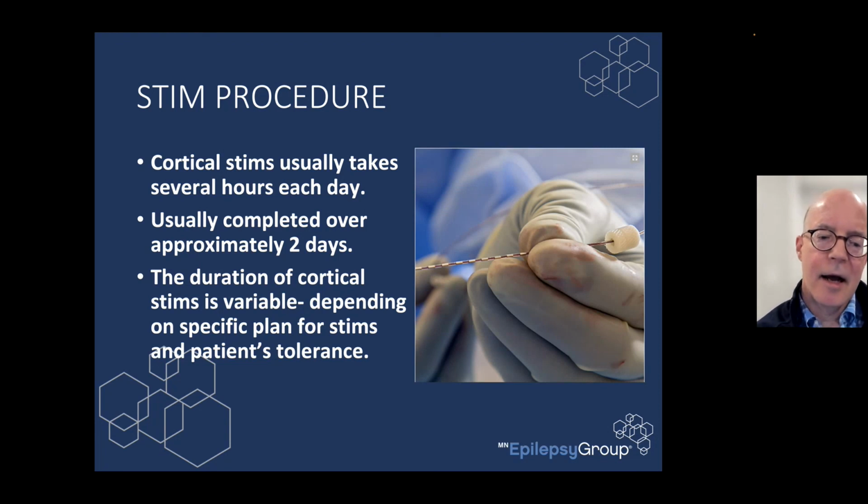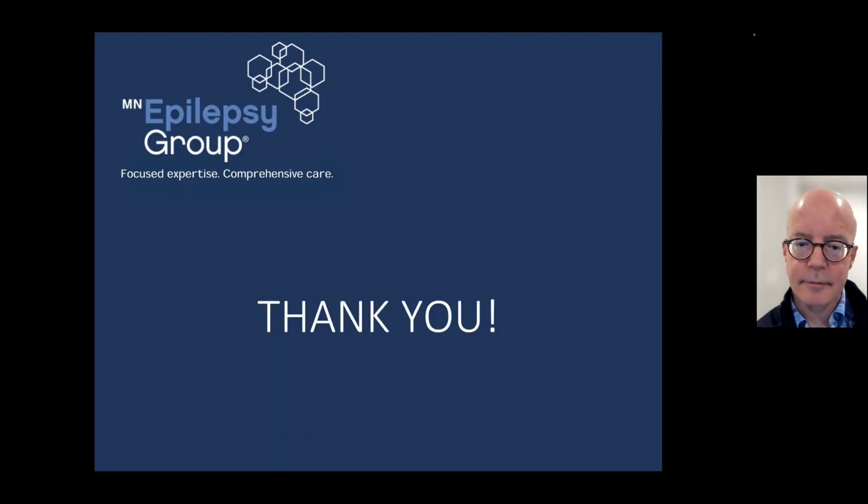I talk about this being variable, the duration of how long cortical stims will take, very much tailored to the patient's needs and also to how they tolerate it. It's a long procedure, tedious for everybody, but especially that patient in the bed who's going through it.